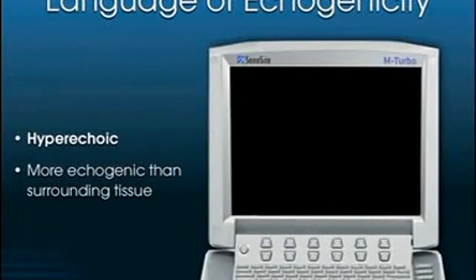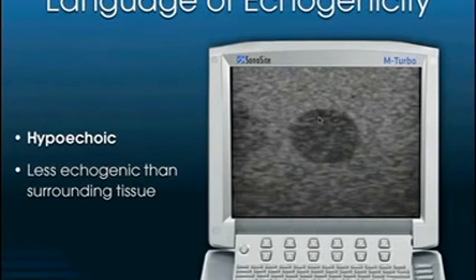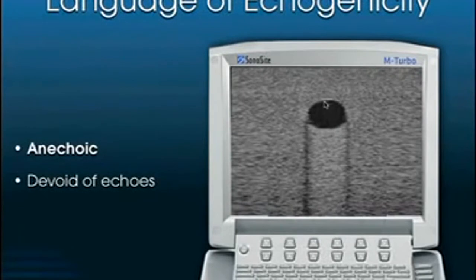And that term brightness, a better term for it is echogenic. So a structure is hyperechoic if it is more echo bright than the surrounding tissue, or more echogenic. Something is hypoechoic if it is less echogenic than the surrounding tissue. And finally, something is anechoic when it is completely devoid of echoes and is jet black compared to the surrounding tissue.